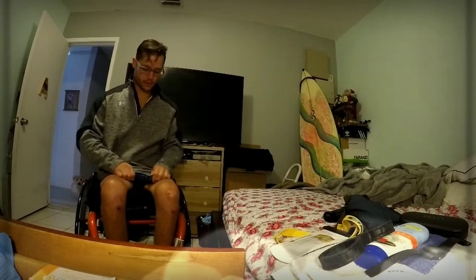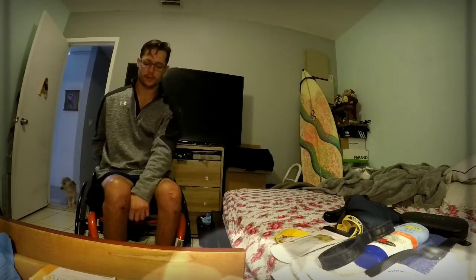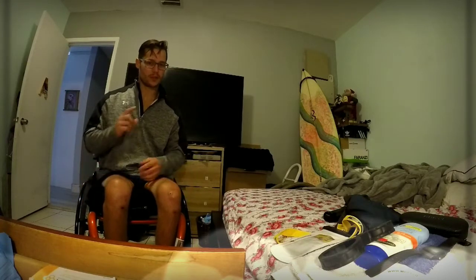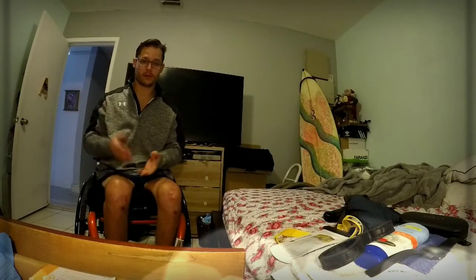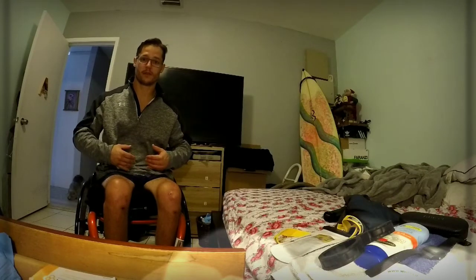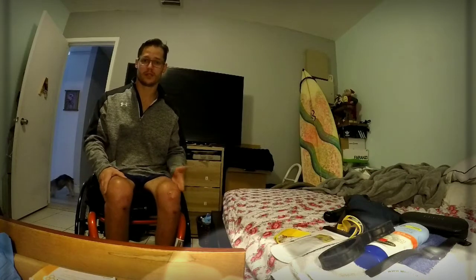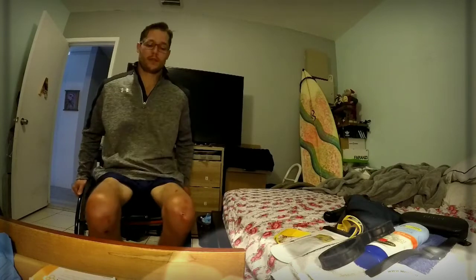Always gotta adjust. Feel the butt. Yeah, everything in the back and the butt area feels good. As long as this stays closed, everything's fine. My legs are exactly the way I want them. Maybe I took out a little bit too much air, but it's not that bad. So that's my tip for your regular ROHO cushion, to have a comfortable butt and your legs aren't floating up in the air. Maybe when your legs are like this is the best. I don't know. I've been in a chair for about a year and two months, so I'm still learning, but I'm sharing my tips with you guys.